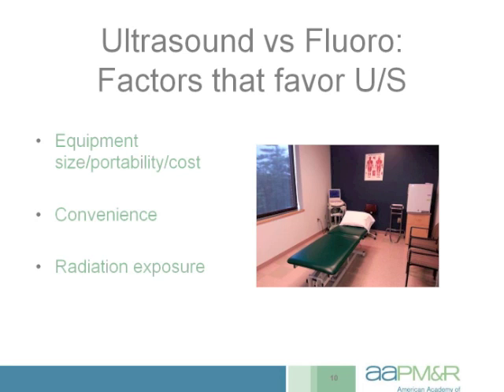In my practice, for all my fluoroscopic procedures, I do them all over at the hospital in the operating room, so it really requires a lot more scheduling and time in order to arrange those procedures than it does for ultrasound in my practice. Of course, in terms of radiation exposure, that kind of goes without saying if we're comparing ultrasound with fluoroscopy.